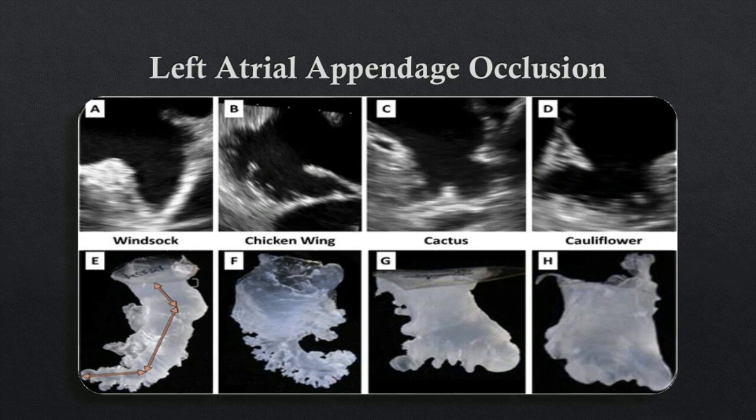Pre-procedural CT planning for the procedure is becoming frequently used, especially with the advancement of 3D software. The left atrial appendage anatomy and orientation can be very complex and differs in every patient, as you see above. This image details the most common types of atrial appendage variances.